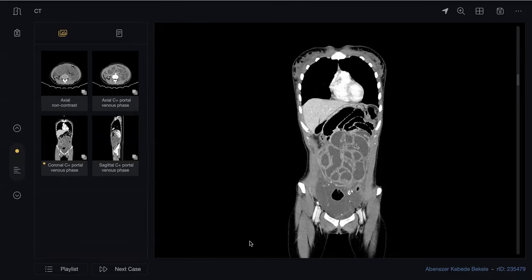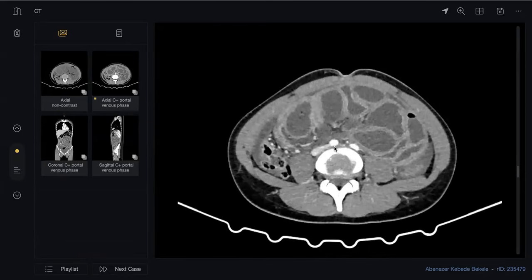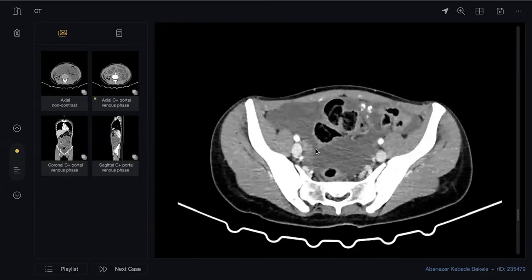If you want to take a look, you can take a look. Yes, I can take a look and further I will complete my management. Now do you see the capsule? Yes, I can see. Okay, good. What is the other name of cocoon?